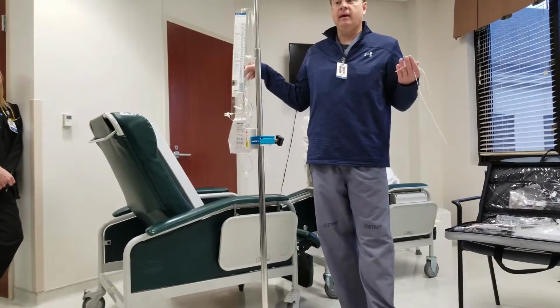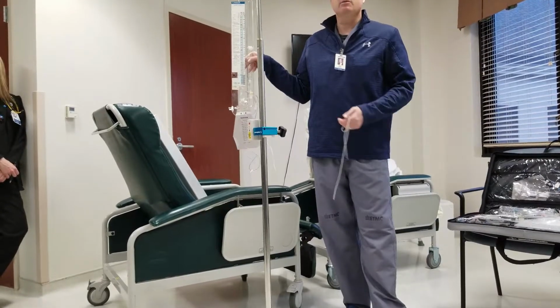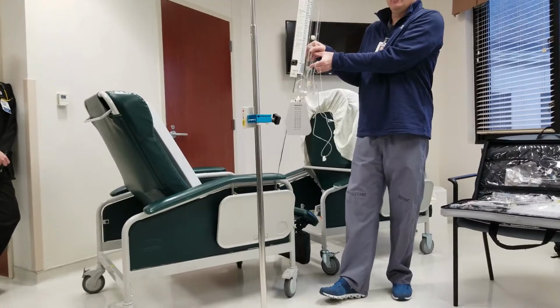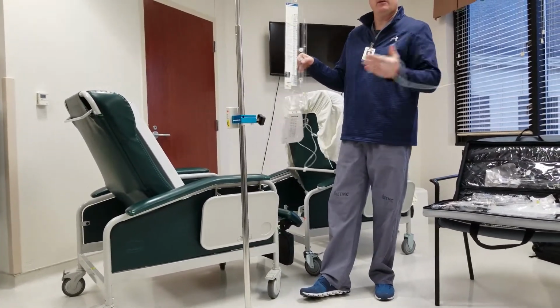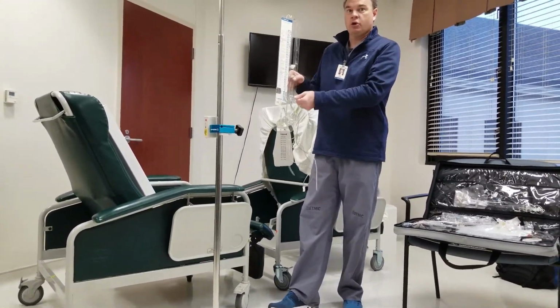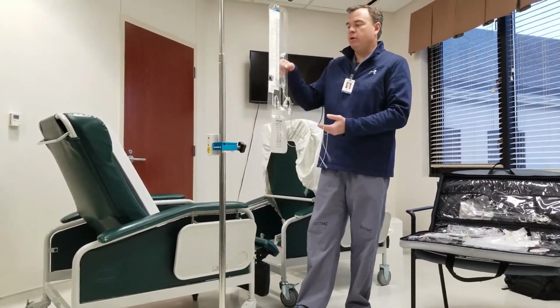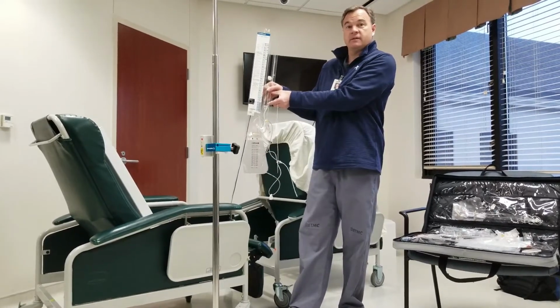Now, if you have another surgeon that is going to manage a lumbar drain and he just wants volume, once you get your certain volume, he wants to take off 40 mLs today just to relieve volume out of the pathway. In that scenario, then you turn it off, right? But you're not in that setting. You're not worried about spatial relations. All you're worried about is this.